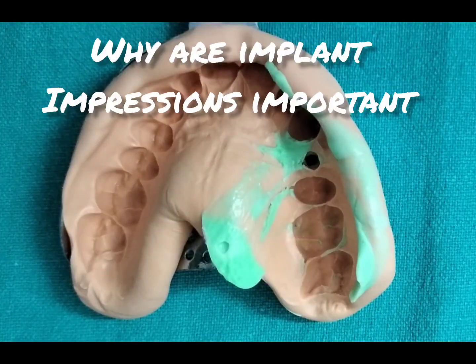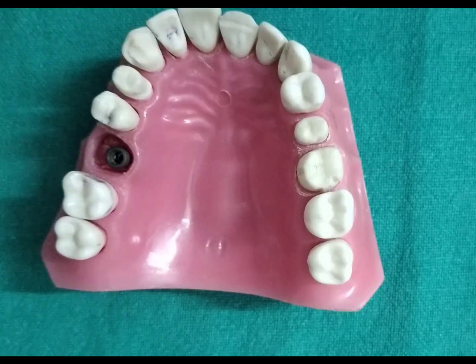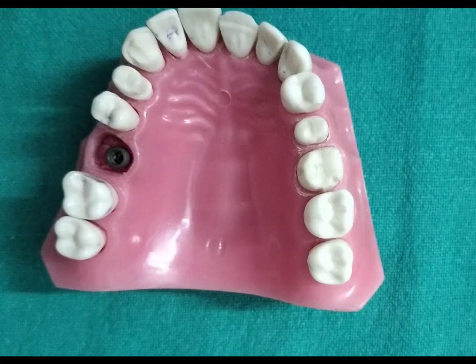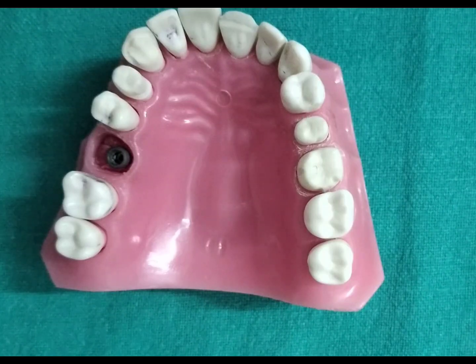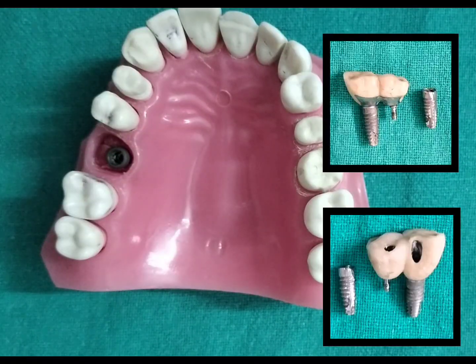So why are implant impressions important? The purpose of implant impression is to accurately transfer the position and angulation of the implant from the patient's mouth to the master cast. Now, if the implant position is not transferred accurately, the prosthesis may not fit properly. Secondly, there could be screw loosening, or mechanical complications such as screw fracture can also occur. Therefore, impression accuracy is extremely important.